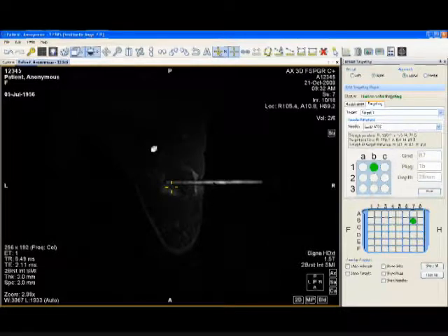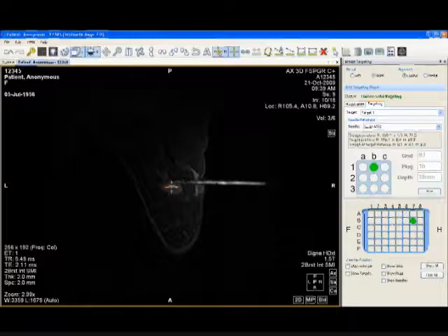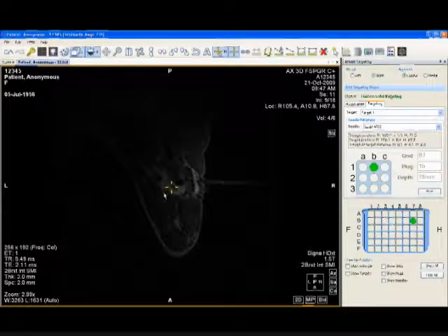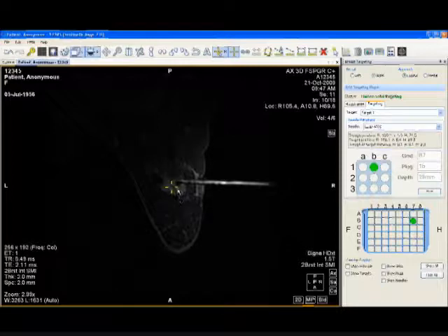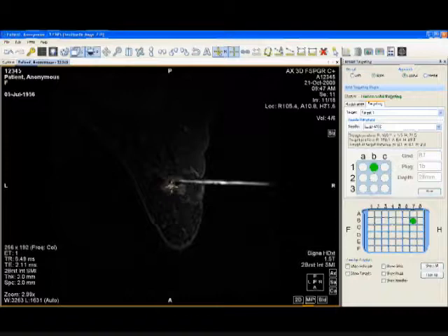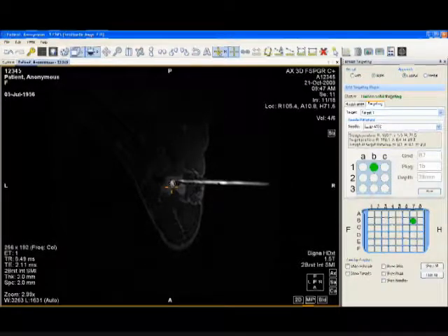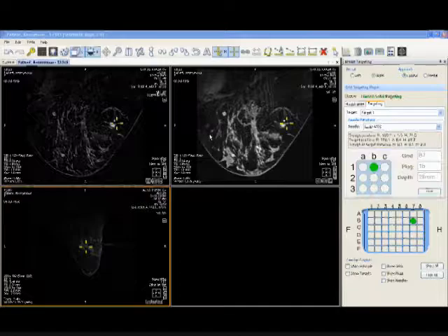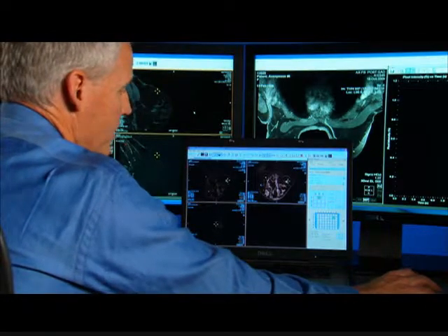At this point we performed a series of biopsies. You can see initially a cavity developed somewhat proximal to this. This is not uncommon when you have an isolated lesion, particularly when it turns out to be malignant, sitting within fat — even though your sample tray may be centered appropriately, you'll see fat getting withdrawn because of the density of the lesion. We did a half sample, only sampling from the obturator distally, and you can now see a cavity resecting the lesion in both projections. This did turn out to be an invasive ductal carcinoma.